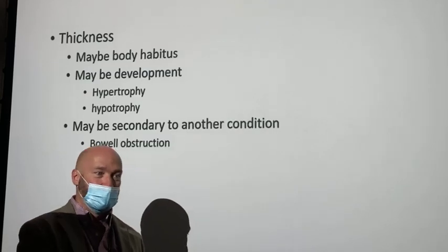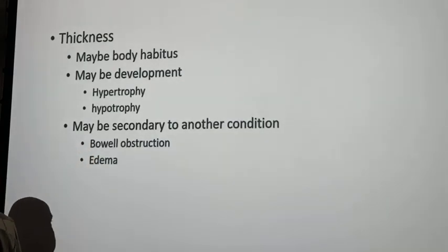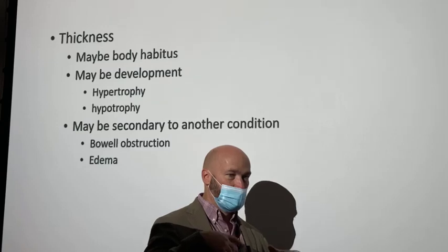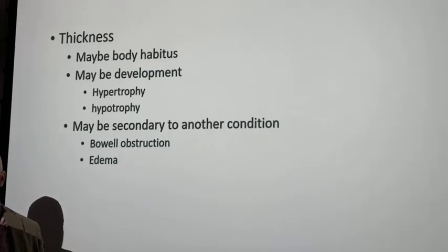But if the doctor had to get in there and dig around for a while before he could put it in, now we've got a chance of the patient having a pneumothorax, a collapsed lung. Collapsed lungs are atelectasis, but pneumothorax is the introduction of air causing that collapsed lung. So ask questions. Find the nurse. Say, how hard was this stick? Are we concerned about a pneumothorax? Because it might affect your technique. Not as much now as it used to with screens and films, but it still could.